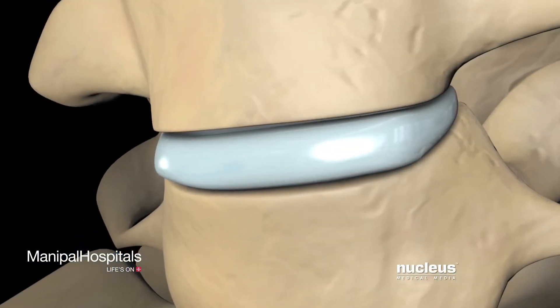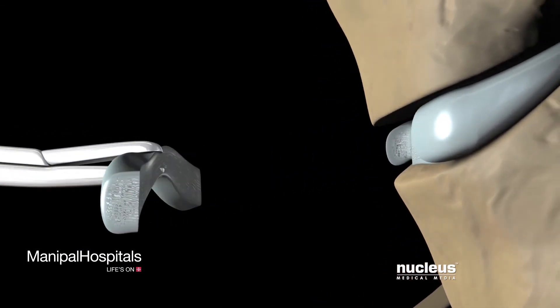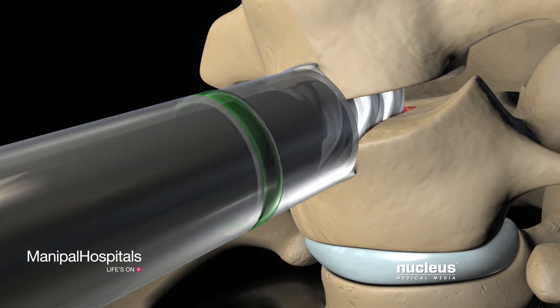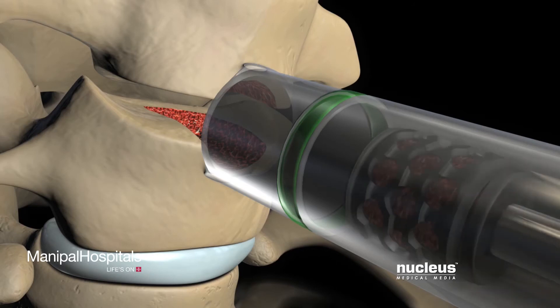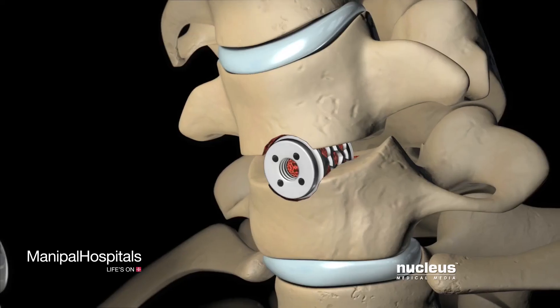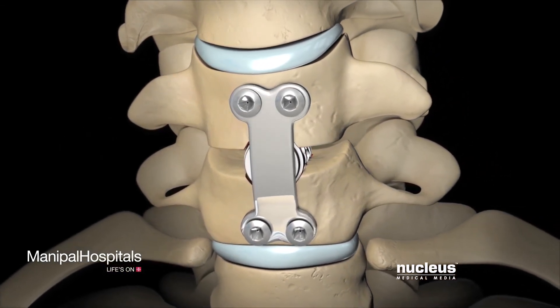Using a high-speed drill and other instruments, your surgeon will remove the disc between the two vertebral bodies to be fused. Next, your surgeon will insert the bone graft into the space between these two vertebrae. He or she may also place a plate and screws over the graft to hold the vertebrae together until they fuse into one bone.